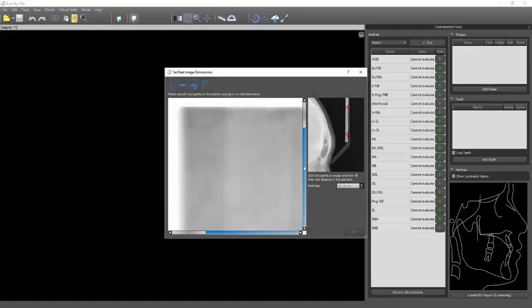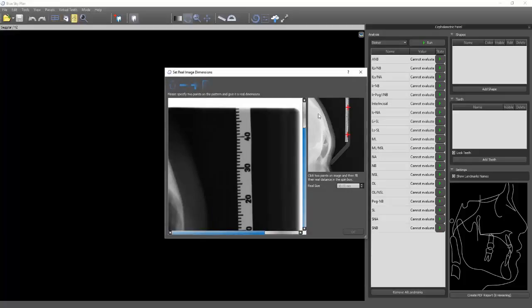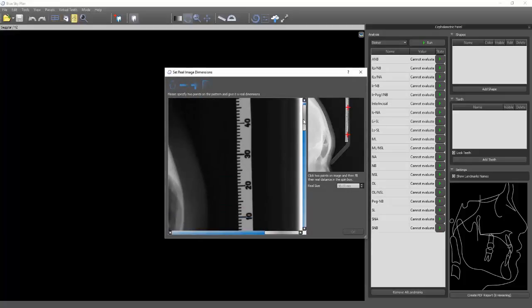So we're going to come here. The first thing we're going to do is make sure we calibrate the image properly. If you see this real size right here, you can change this to whatever you want. Once we've marked the points, I'm going to come here — I know this is 30 millimeters. I can change it, but that works out perfectly for me so I don't need to.